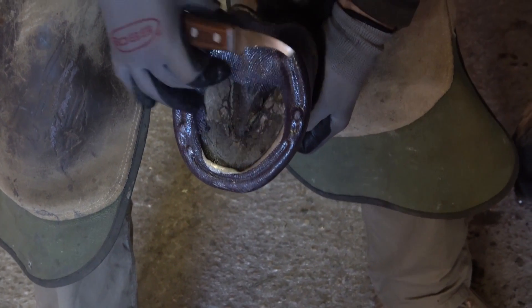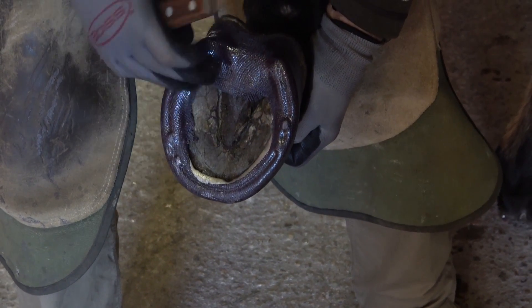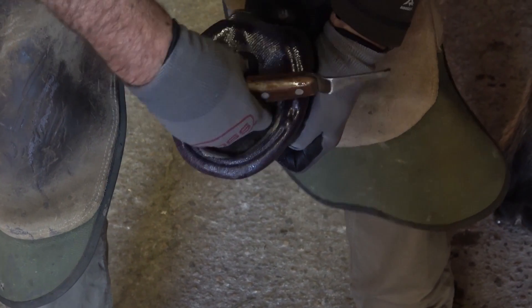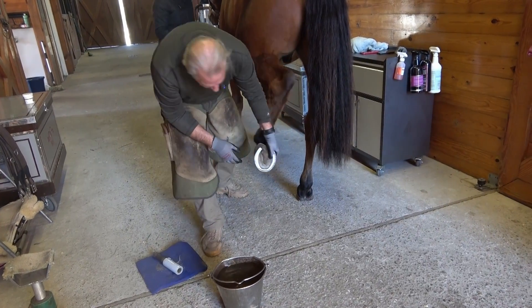There may be instances where you want to temporarily limit caudal foot movement similar to a bar shoe, but not completely re-shoe the horse. Casting over the shoe without any impression material is an option. The process is similar to the previous example.